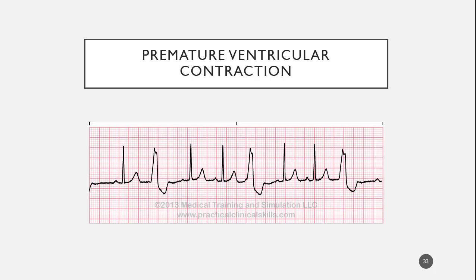Okay. So when you're dealing with this, simply tell me that the normal beats have P waves. The ventricular beats do not. So what do you notice about the PR interval for P waves that are there? Normal. Okay. What do you notice about the normal QRS complexes?